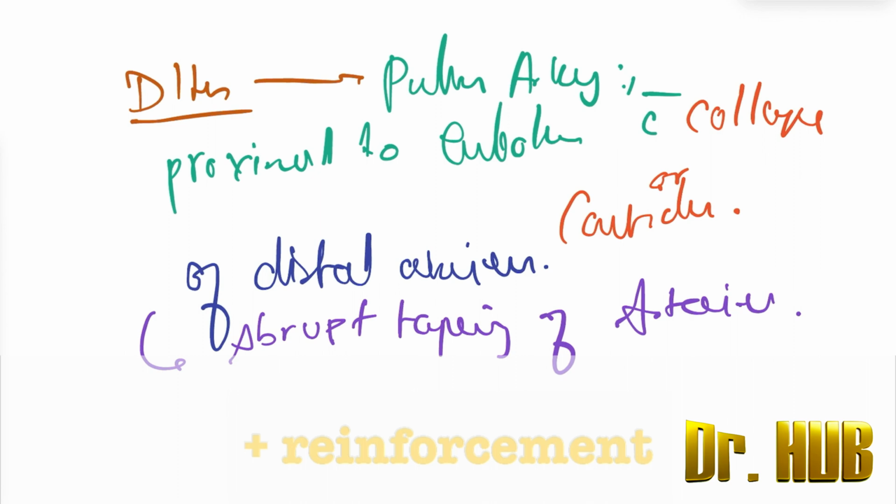So this was totally about pulmonary embolism and the signs. We had discussed the Westermark sign, the Hampton hump, the Palla sign, the Fleischner sign, the melting sign, the McConnell sign, as well as the knuckle sausage sign. So that covers everything in pulmonary embolism.